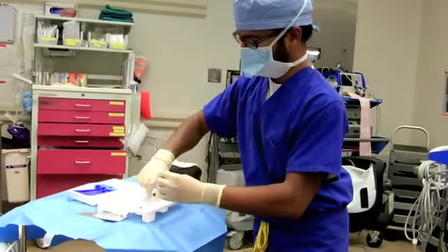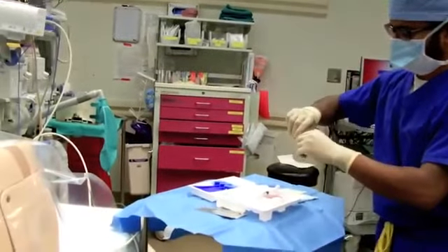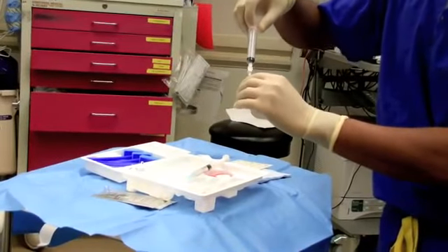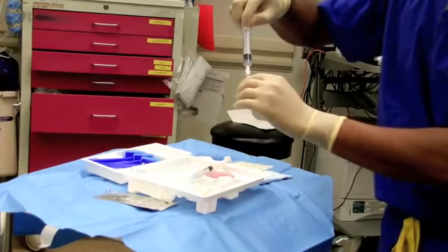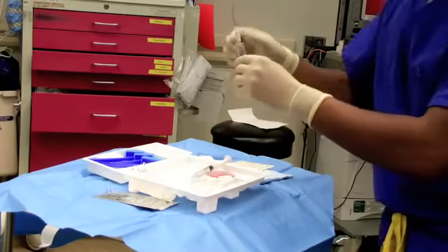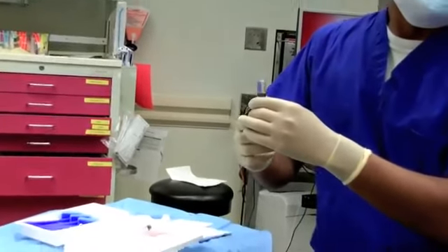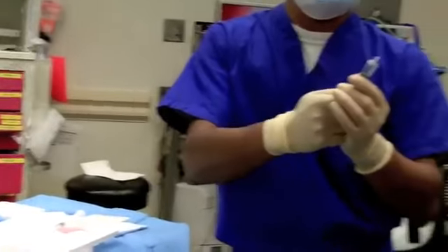I was using this filter needle. The dose of bupivacaine ranges, so you have to decide what you need for that clinical case. I'm going to ask my assistant to apply morphine into the bupivacaine sterilely.